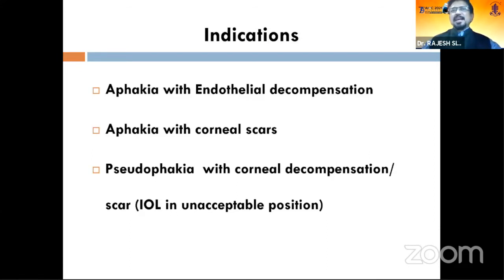Now, these things are there. But there are certain conditions wherein you can't even put an anterior chamber IOL, wherein there is a narrow angle, iris badly damaged, and various other scenarios. Patient has to undergo an endothelial keratoplasty in a subsequent stage. So in such cases, you would want an implant to be a little further away from the graft endothelium. And that is why I prefer doing the intrascleral haptic fixation or SFIOL.